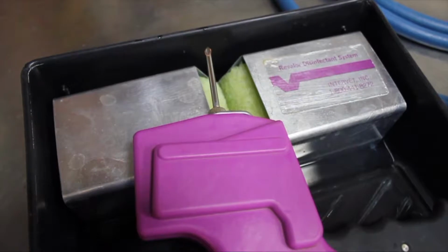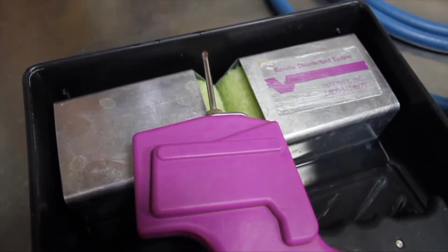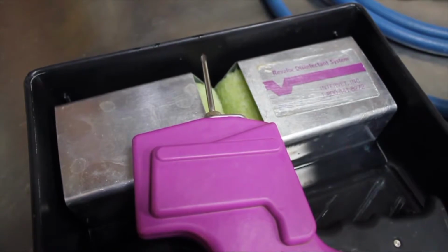The last thing to keep in mind is I like a disinfectant tray, and it's no less than a paint tray for a paint roller with a disinfectant soaked sponge at the end. So we can set that implant gun on the tray where the needle lays directly on top of the sponge that has disinfectant in it. And if we have all that together, we're pretty much ready to go. Well, let's take a break and then let's do it.